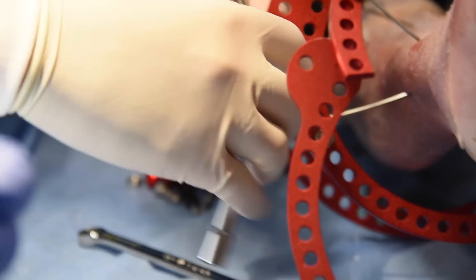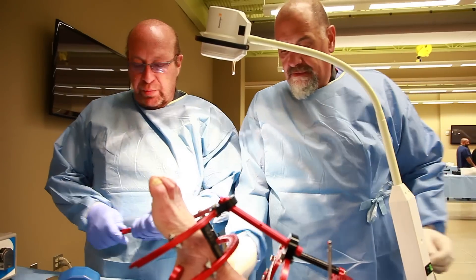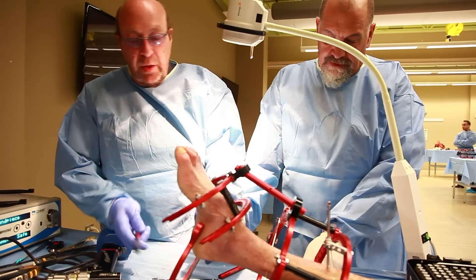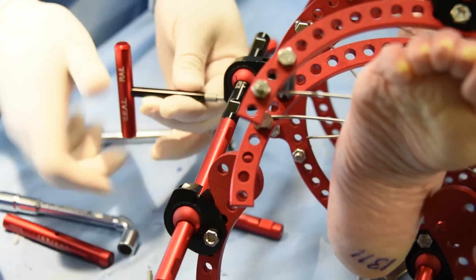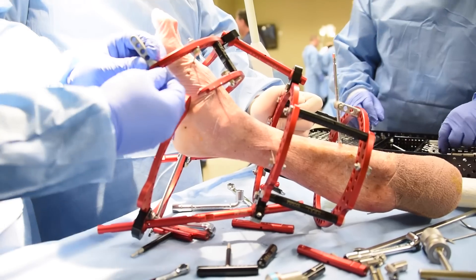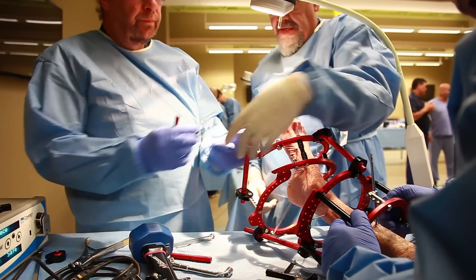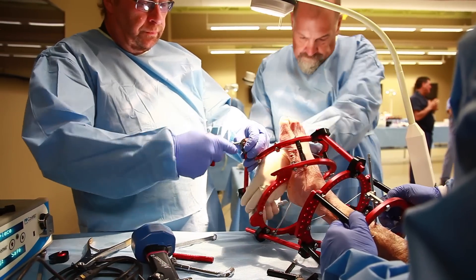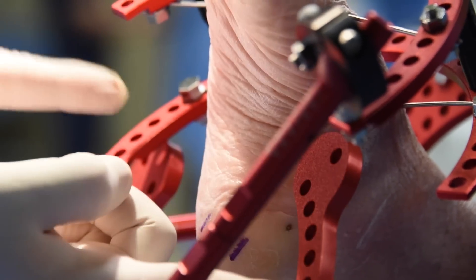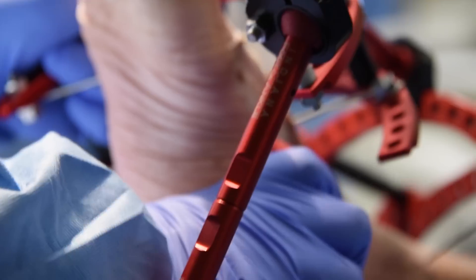This is a percutaneous reduction of the calcaneal fracture, which is probably one of the most difficult fractures to treat in the body. You can put this anywhere you want — you take one post here and a nut. You can bring that plate out and rotate anything you need to. But if you look at this, you cannot move this frame.